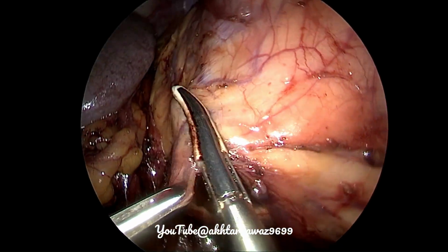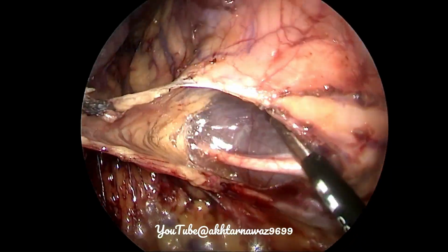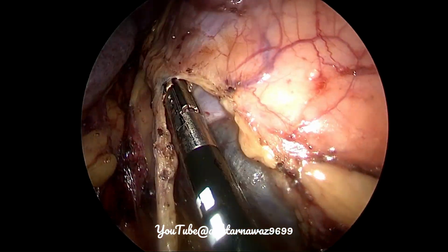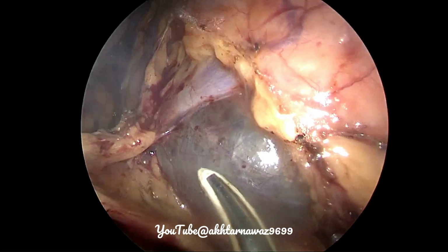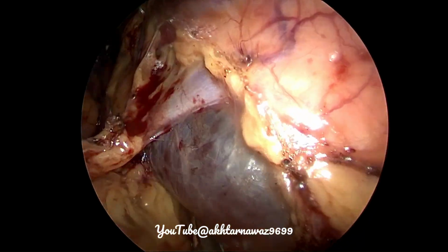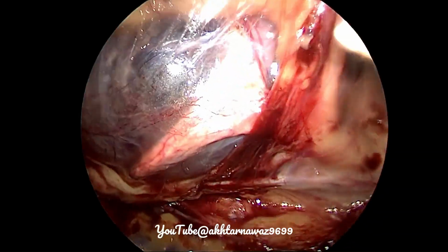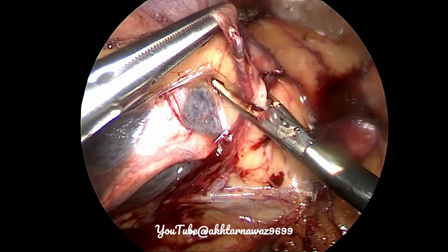Basically what happens is that when there is a parapelvic cyst, the cyst usually arises from within the hilum of the kidney, and it splays the pelvic calyceal system away. So the upper, the middle and the lower calyces are very much long, with long infundibuli, and they are splayed away.